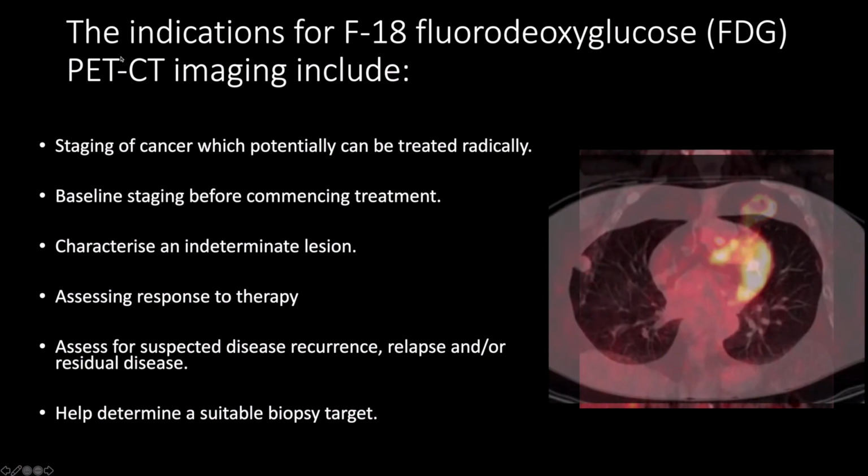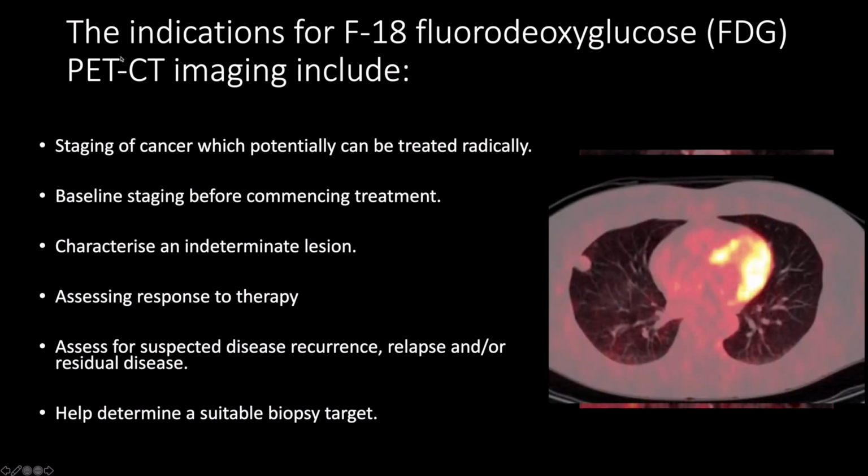It's very good for characterizing indeterminate lesions too. So this is an example of a lung nodule which doesn't show any uptake on the PET scan and turned out to be benign.